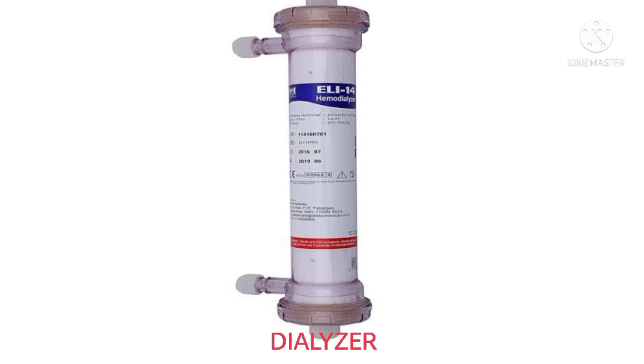External arteriovenous shunts are rarely used. The internal arteriovenous graft is used for chronic dialysis when the arteriovenous fistula is not possible. In this approach, an artificial graft made of various synthetic and biological materials is used to create an artificial vein for blood flow. One end of the artificial graft is anastomosed to an artery, tunneled under the skin, and anastomosed to a vein. The graft can be used 2 weeks after insertion. Complications include clotting, aneurysm, and infection.